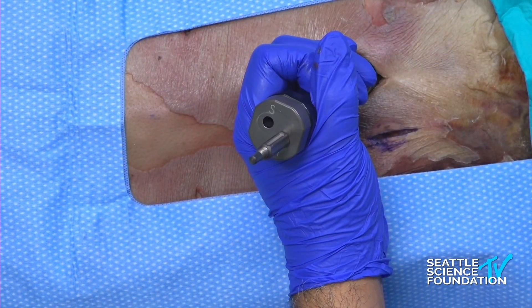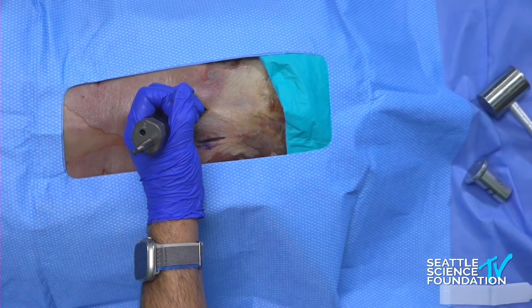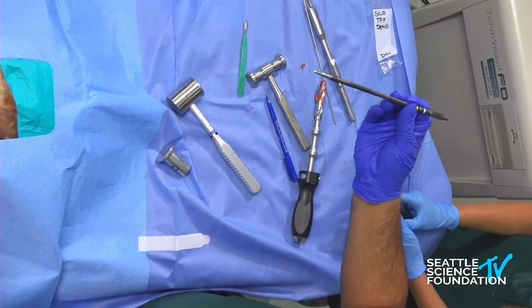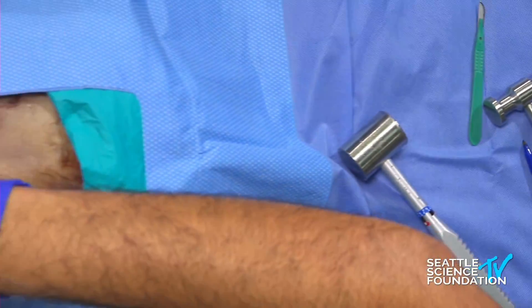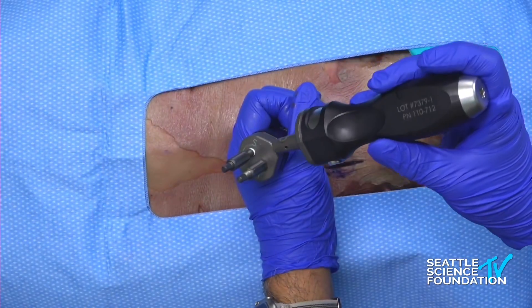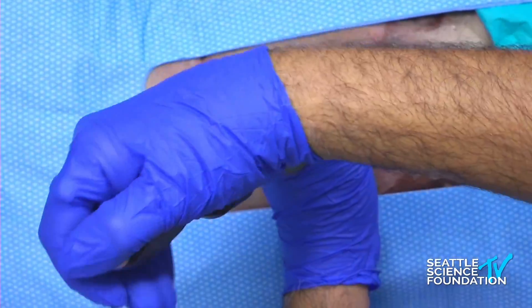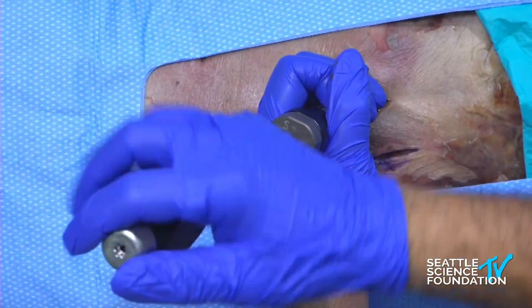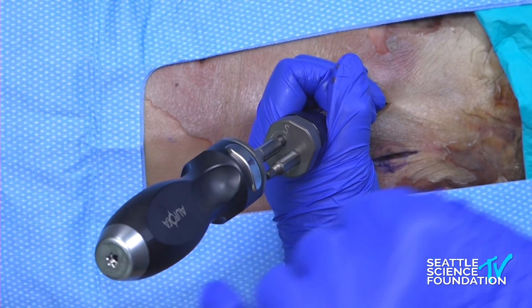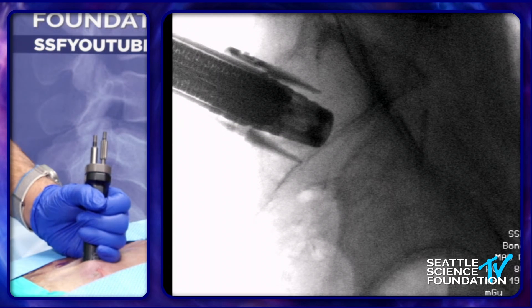The screw comes out and you hand it to your tech. The tech loads up the screw — all of these are color coded, so most of the time you don't have to remember. You can see the screw right there, and you go ahead and deploy it. There's a white line — all you have to do is push down and go a few turns. You'll see a recoil — that means you've attained the transfixation for the sacral screw. The next thing is to go to the ileum screw.